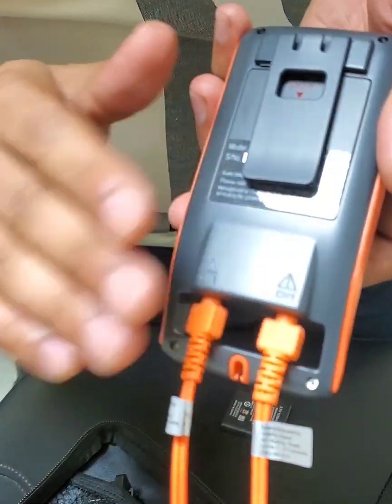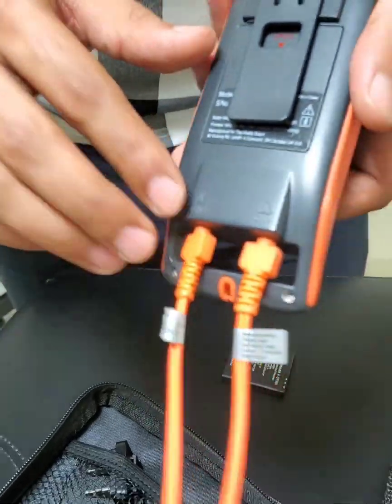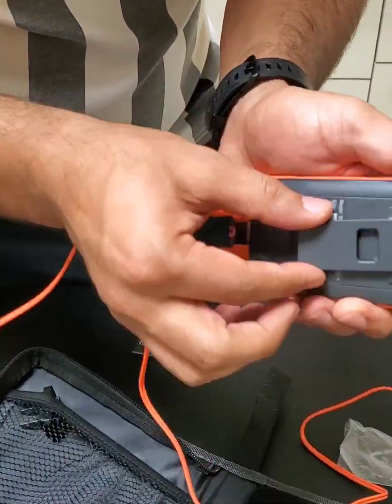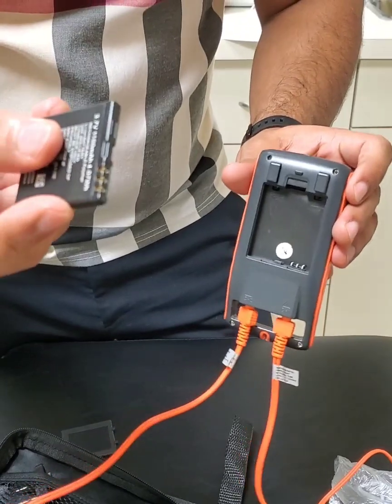It doesn't matter which one you put into which — they're both the same thing. But there is a channel 1 and a channel 2. Next, you're going to take the battery out. You pop it down and it slides right out, then you pop it open and put your rechargeable battery in here.